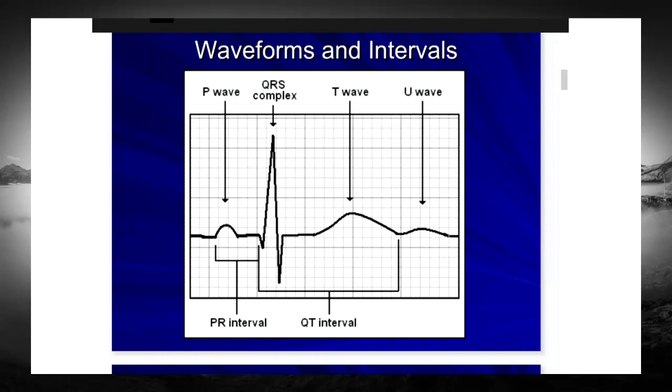And then our PR interval, what is that? A little louder. So yes, but it is basically the depolarization of the atria to the depolarization of the ventricles, that period of time. And the thing you want to make sure you understand is that when we're looking at this graph, the ECG, you can see the graph paper, remembering what our Y and X axes are.